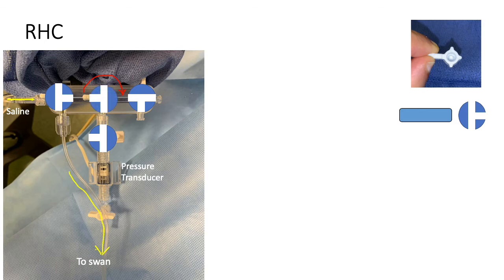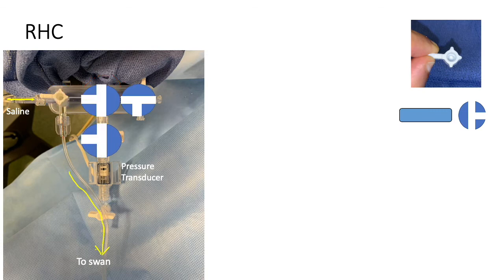Now you will see that the transducer is in direct communication with the Swann-Gans catheter. And this is how you can measure right heart pressures.